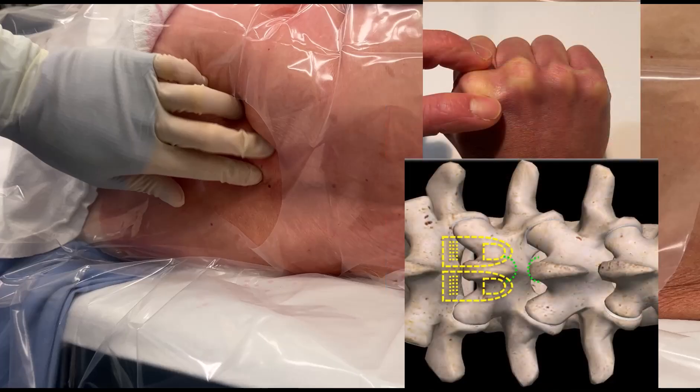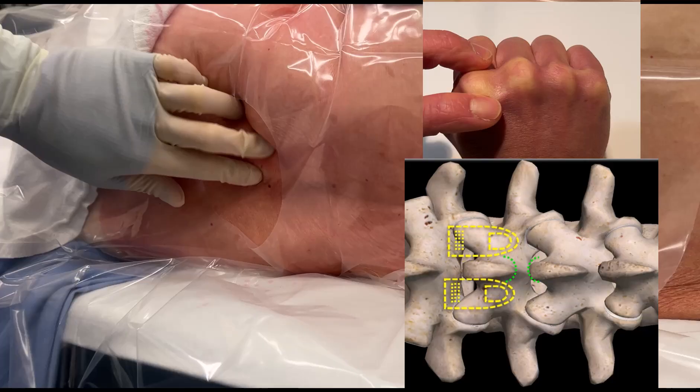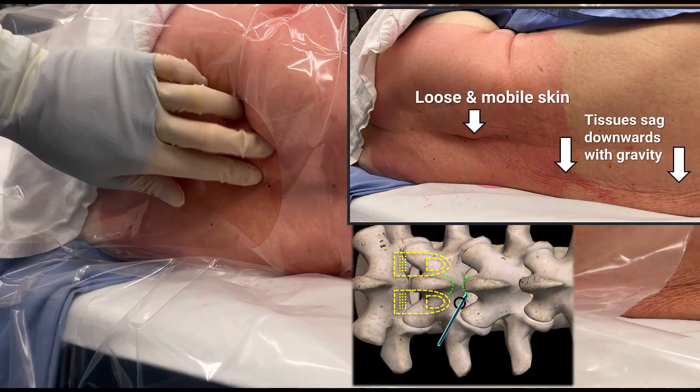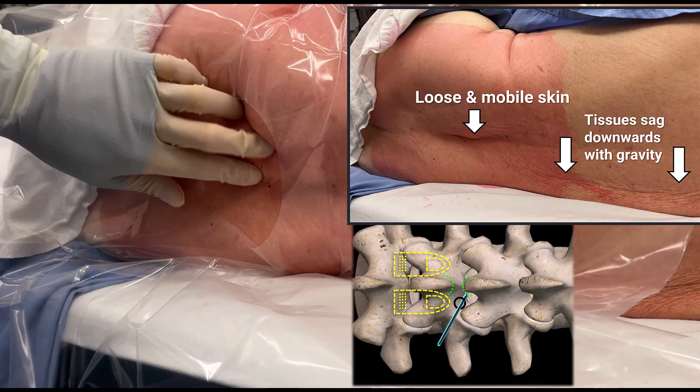Having located a potential interspinous space, the fingertips are now spread to straddle the width of the spinous process. This maneuver is critical as it fixes and stabilizes the loose skin in place over the underlying bony landmarks and improves the precision of needle insertion through the skin towards the interlaminar space. Your fingers also serve as tactile and visual cues to the position of the spinous process, which is key to triangulating your needle trajectory.